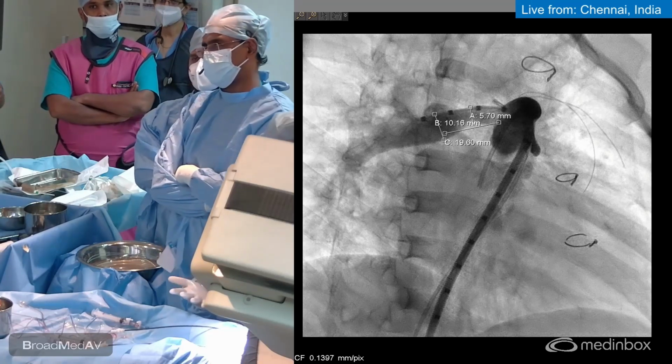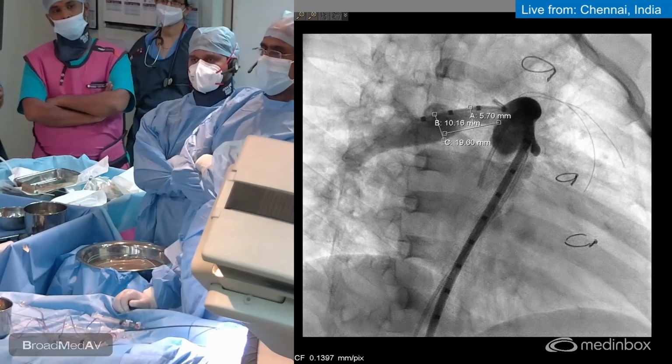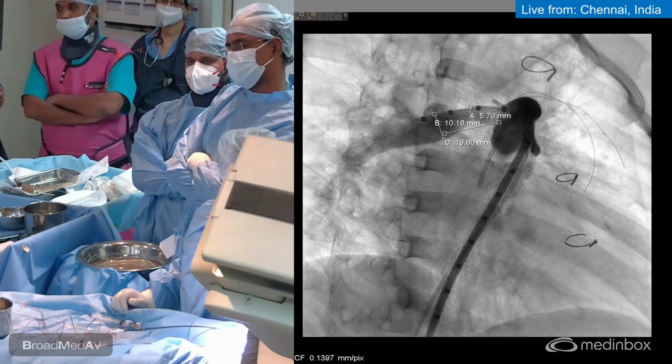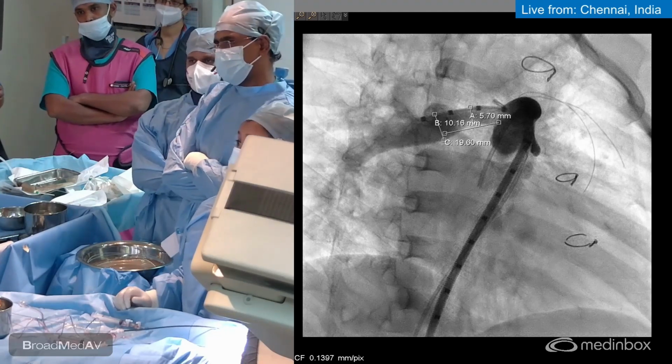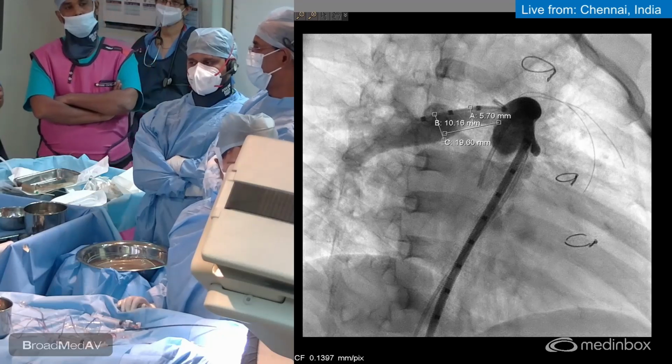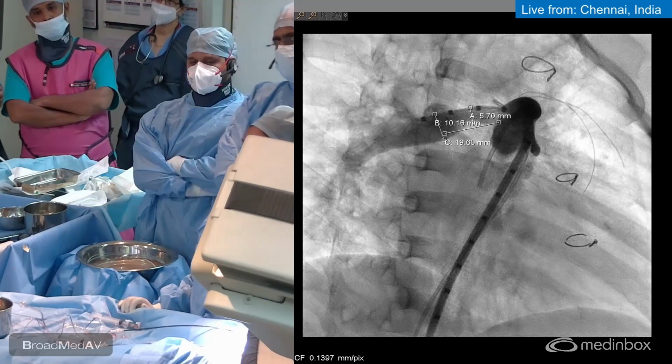So fortunately now we have two other types of stents. One is the platinum iridium stent, that is the Cheetham platinum, and the cobalt chromium stents. These are two stents that are the newer stents. Having said that, a large majority of pulmonary artery stents are still done with stainless steel stents.